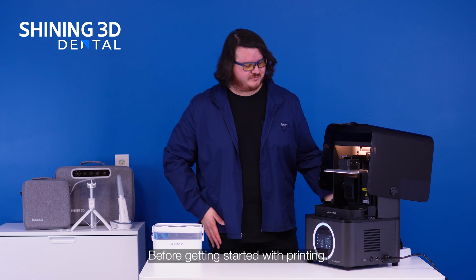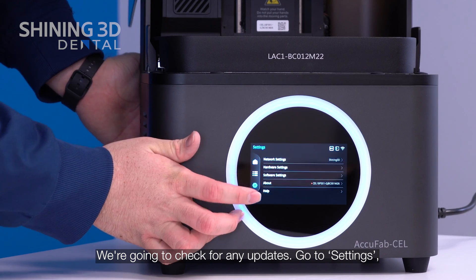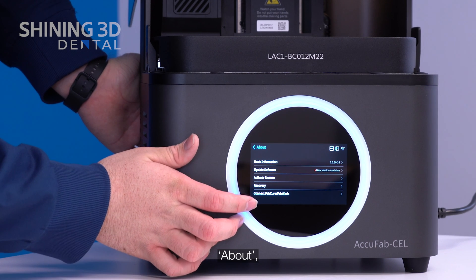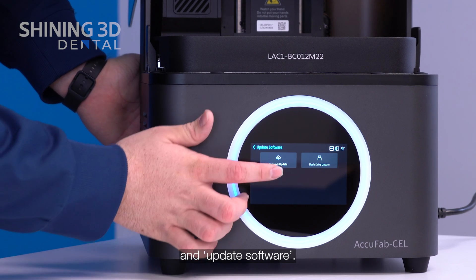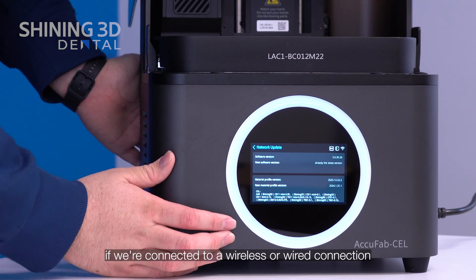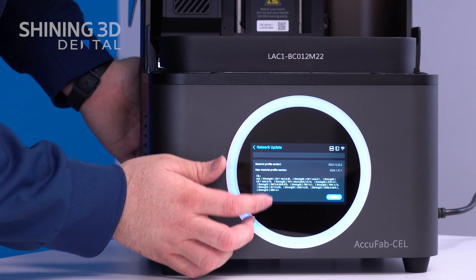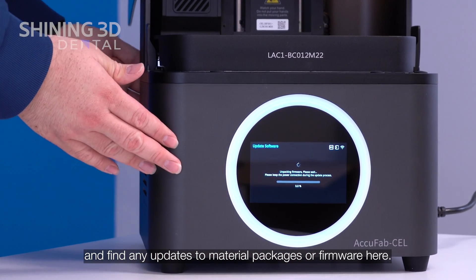Before getting started with printing, we are going to check for any updates. Go to Settings, About, and Update Software. We can select network update if we are connected to a wireless or wired connection, and find any updates to material packages or firmware here.